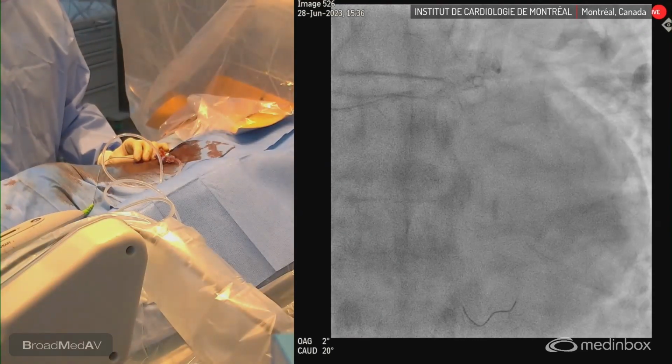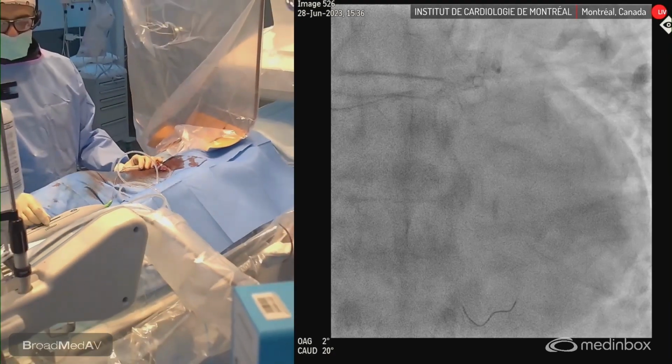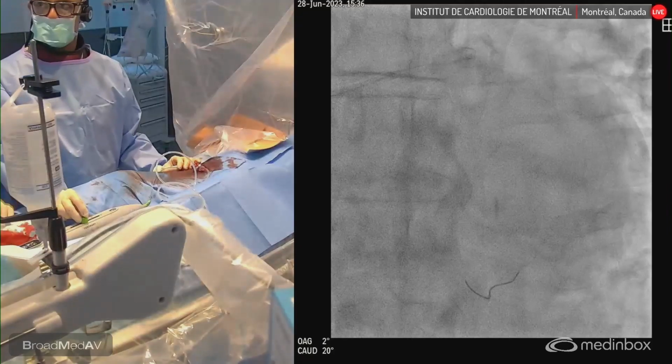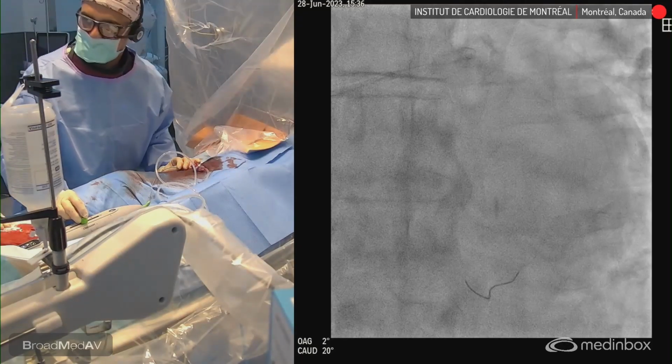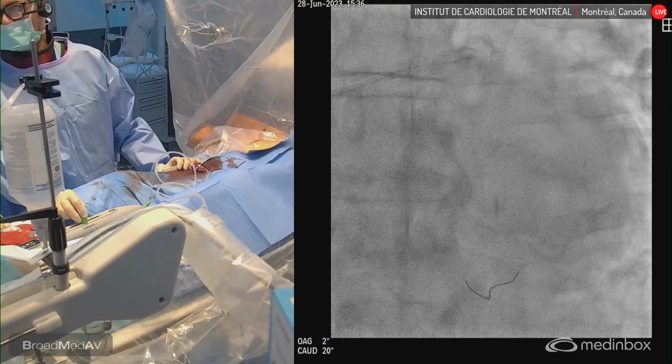So we have to engage the brake. So we push the green thumb thing down, and then I release a bit of the pressure. Okay, and then I'm going to start it. I'm going to listen for tonal changes. Do I see the console somewhere? The console is there, yeah. Okay, good. Perfect.